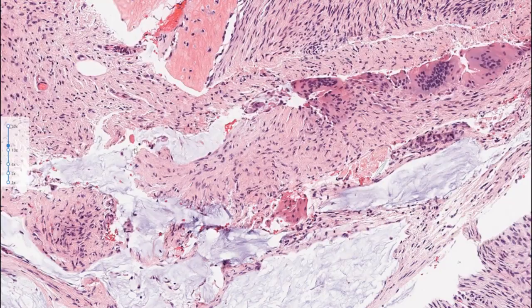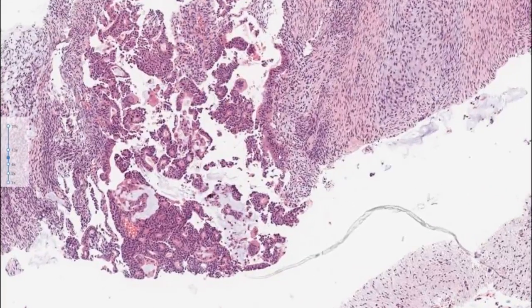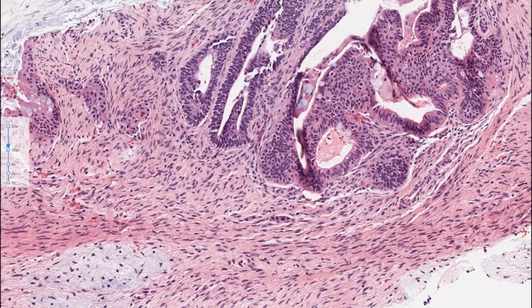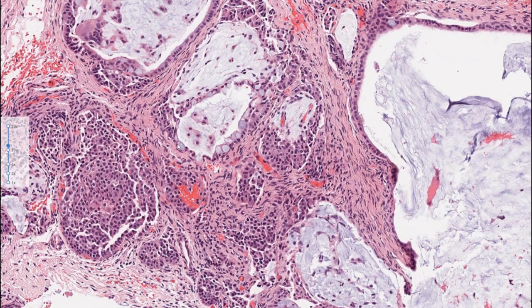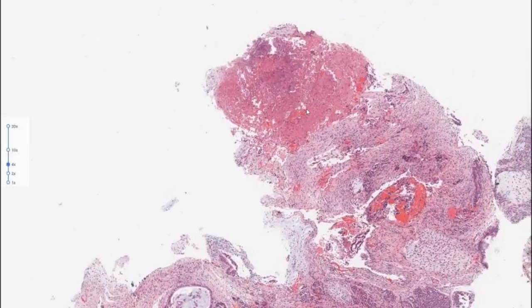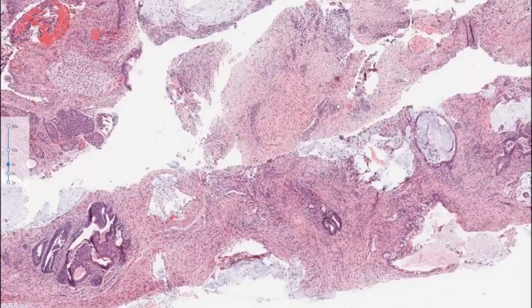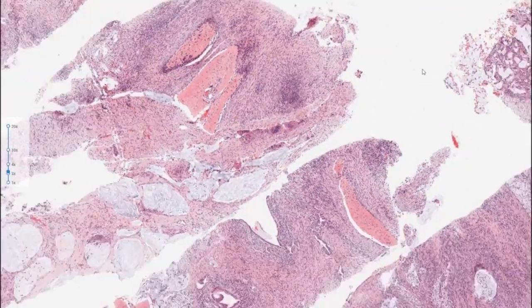You even had a real giant cell reaction, a myxoid change, and glands. Okay, you have glandular formation in this case. Well-formed glands, and some of them had really well-differentiated goblet cells. This patient is young, so metastatic carcinoma was not something considered in the differential diagnosis. Some sort of teratoma or germ cell tumor is something to have in mind in this case, although here the history is very telling.